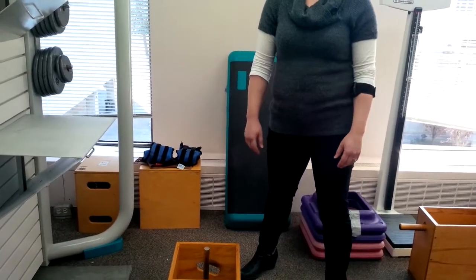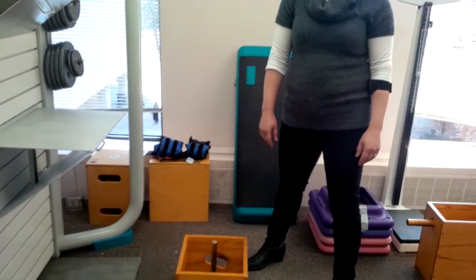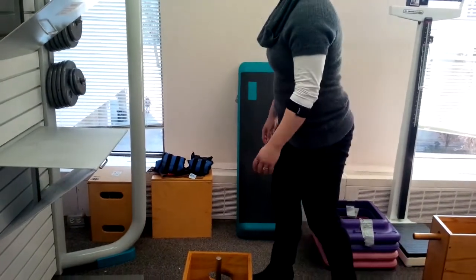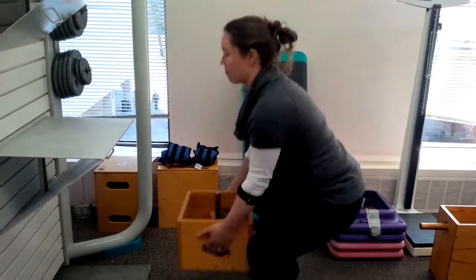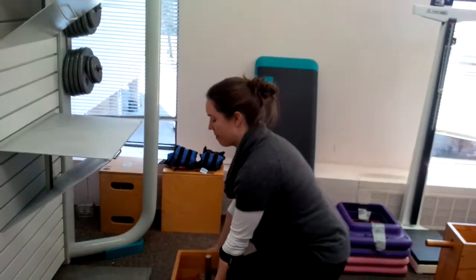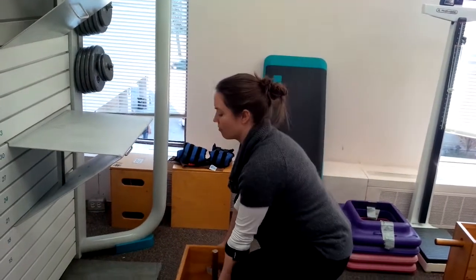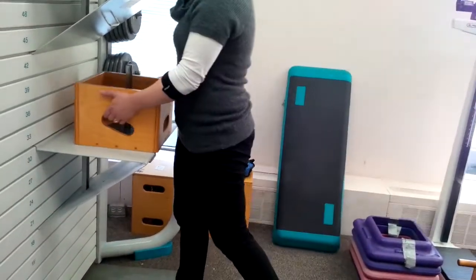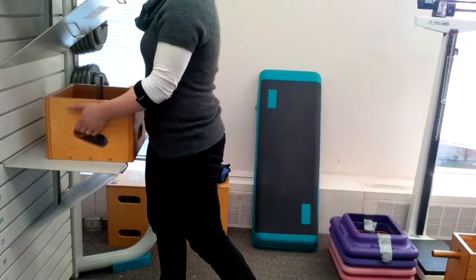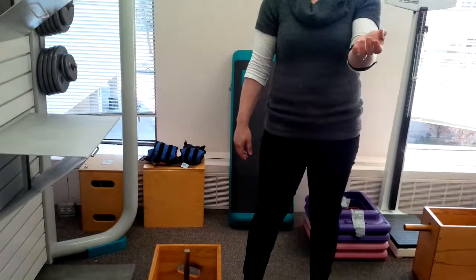93. 93. And what was the maximum heart rate you got to in the rest period? 112. 112, okay, so 93 — go ahead. So all the way up for number 1. I usually typically walk them through, and all the way back down. All the way up for number 2 and back down. That's keeping them on pace. All the way up for number 3 and back down. All the way up for number 4 and back down. And relax. So watch their heart rate for a few seconds.